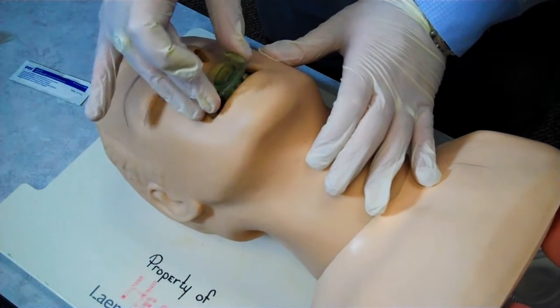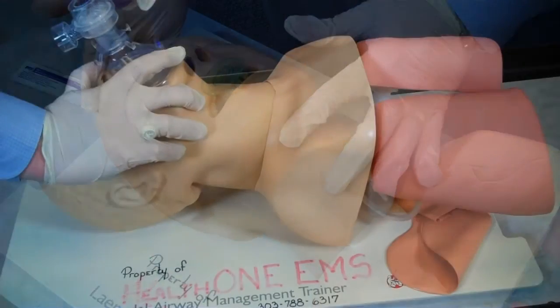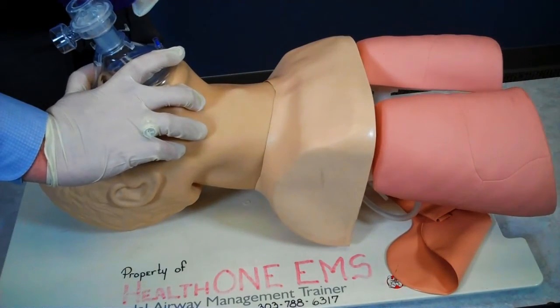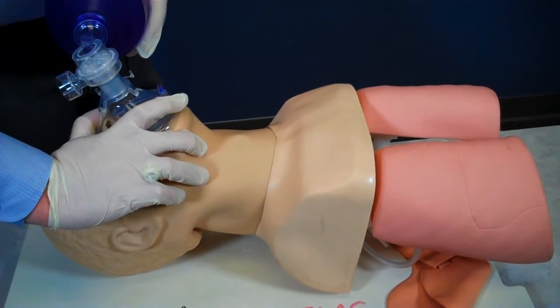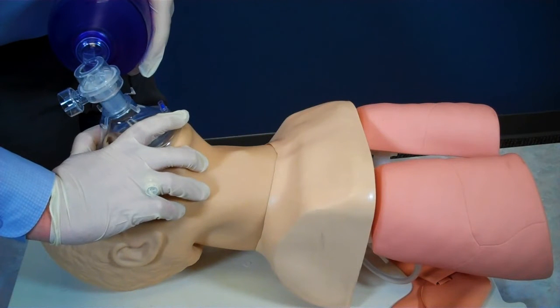Once I'm sure the patient has accepted the airway adjunct, I will ventilate the patient with a bag valve mask. When I'm sure ventilations are being performed without difficulty, I will attach the BVM to oxygen and set the flow rate to 12 to 15 liters per minute.